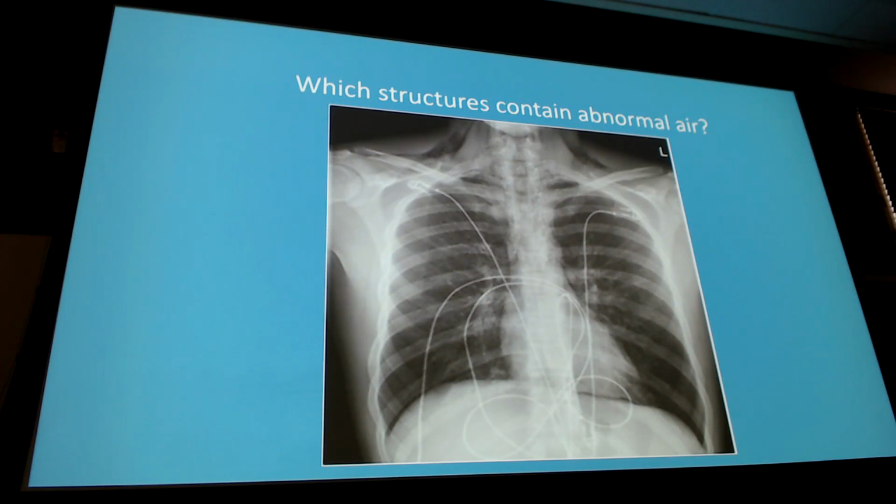Okay? What's going to be hard to see on the x-ray is the initial cause of this. So this was somebody with the interstitial emphysema that then got into the mediastinum because it was right in this area, and then the pressure from that pushed it out of the mediastinum up into the subcutaneous tissue. So that's the stepwise process of that.